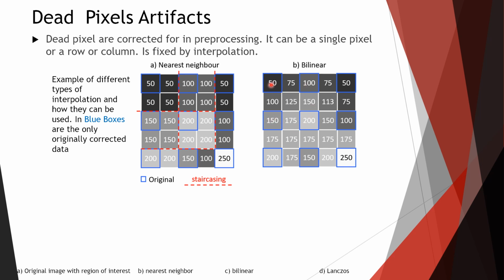This is the 100 right here, which is the missing data. It's averaging these two. So this is going to be a better representation because it's more gradual. The gradient's less sharp. The change from here to here is probably going to be more accurate when 100 is put here than 50, because it's going to go 50 to 150 here to represent the actual data.